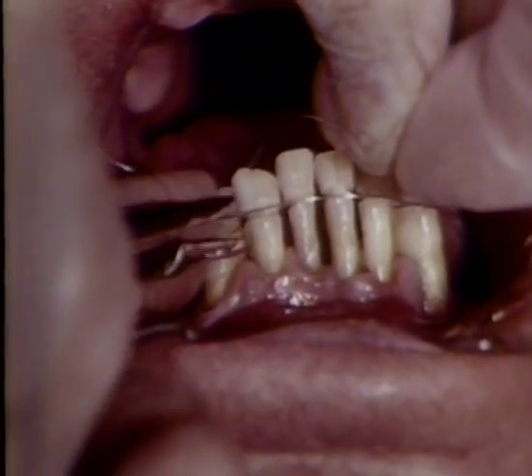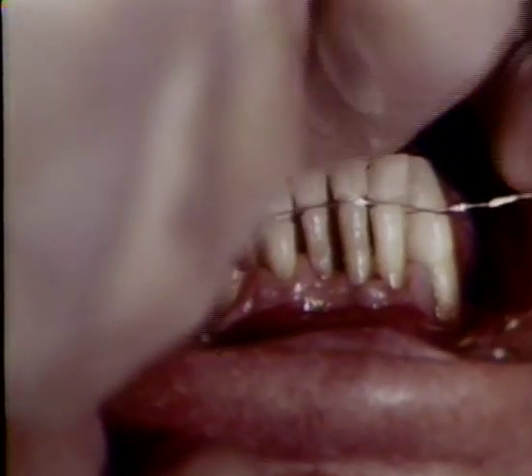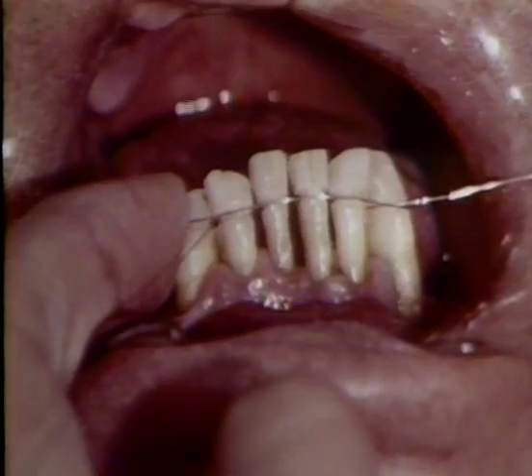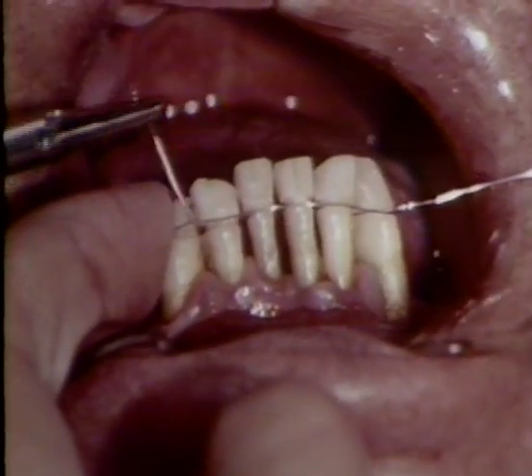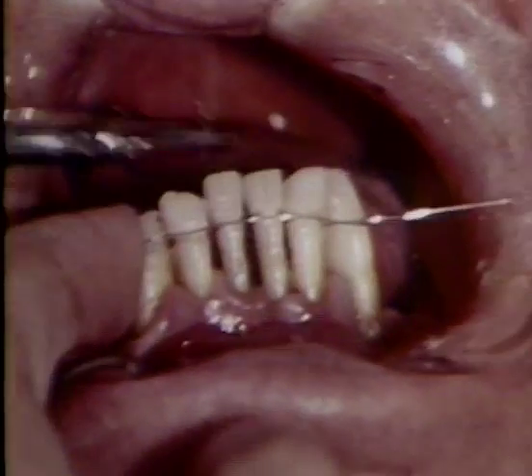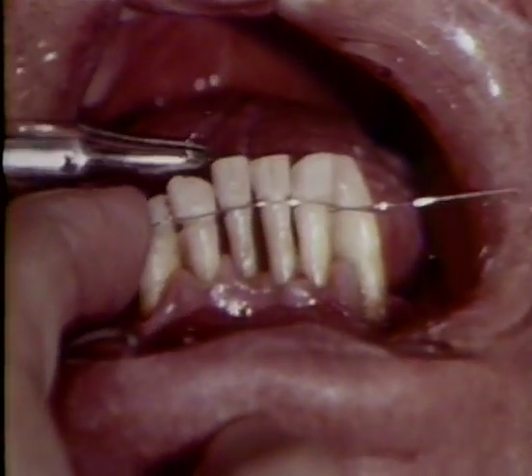The wire is passed interdentally from the lingual to the labial surface under the master wire and carried over the master wire back through the lingual aspect. This is below the level of tooth contact.